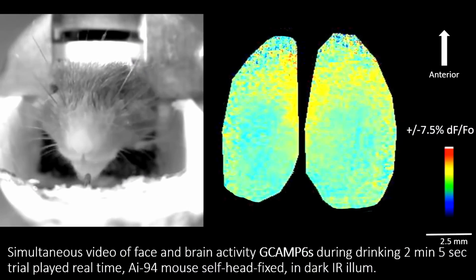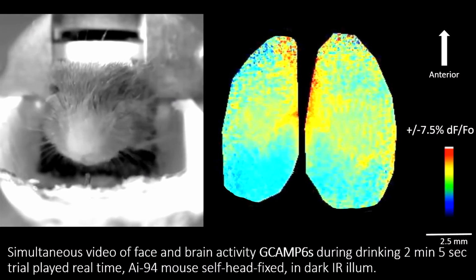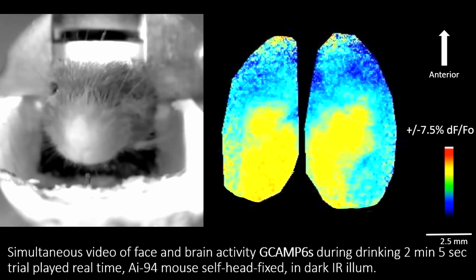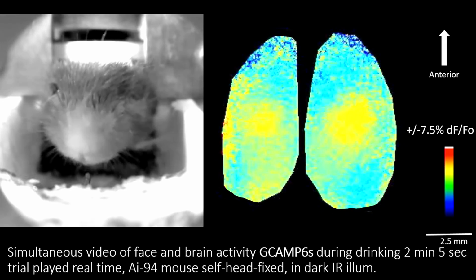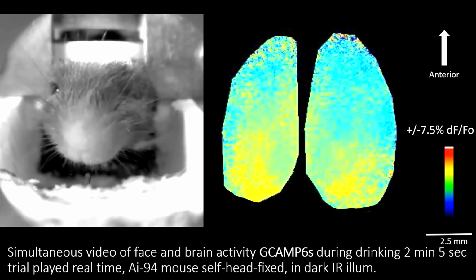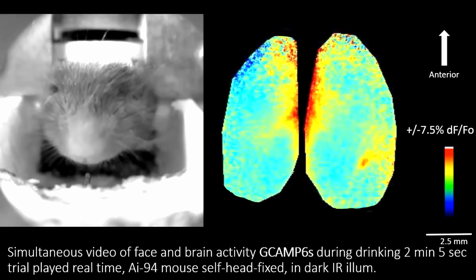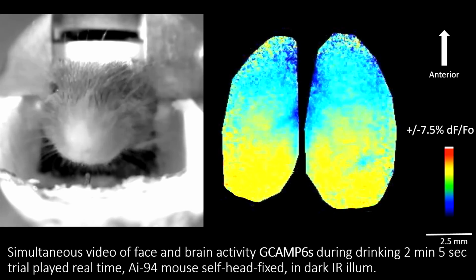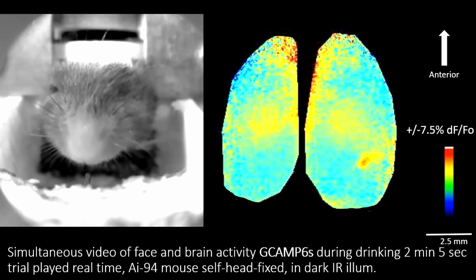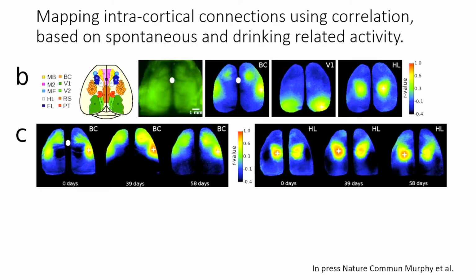And this is some of the data. We're still analyzing this. So this is video of the face and then brain activity simultaneously. And the closer we look at these mice, the more things we realize they're doing with their whiskers or sniffing. It's going to be very, I think, a challenge classifying this. The tail moves a bit in the back. So now one thing we're doing is having multiple streams of video from the body, and you'll see the water reward here. And then this is the millimeter scale, both hemisphere imaging.